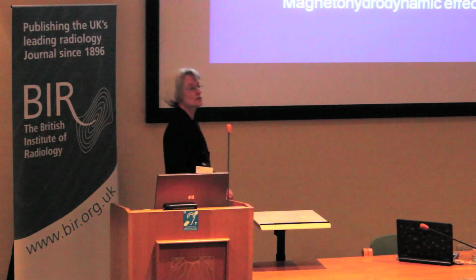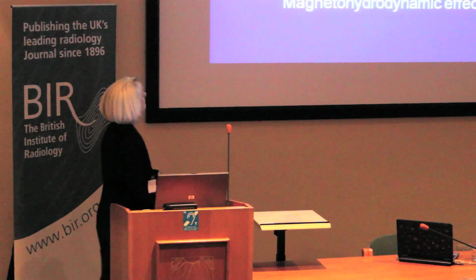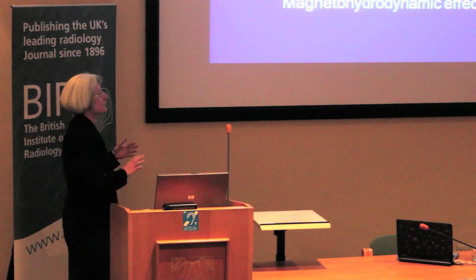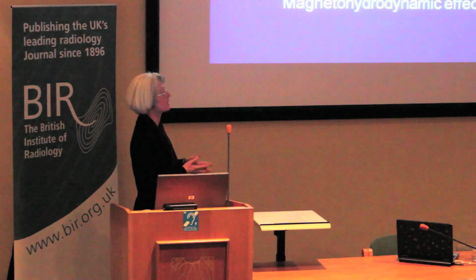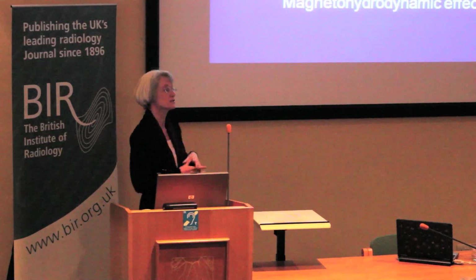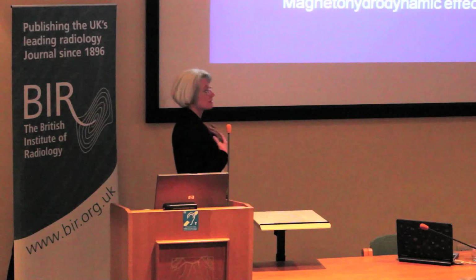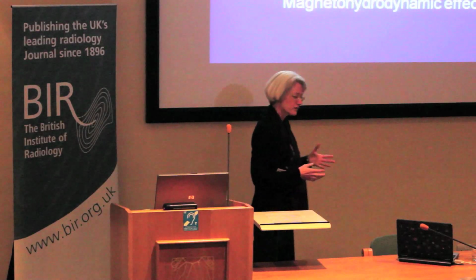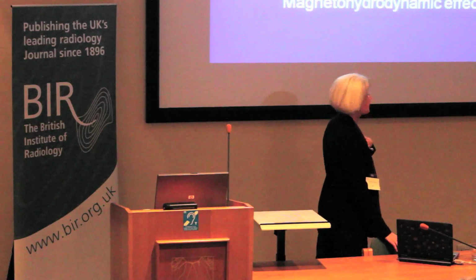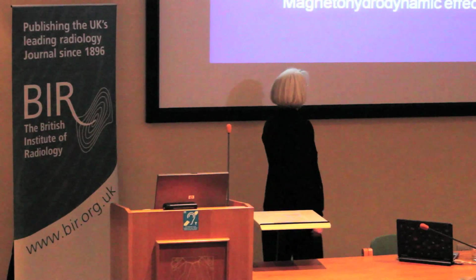The other is, as you all know from your GCSE or O-level physics, you get induced currents. If you have something that's conducting, moving in a magnetic field, it will induce currents in the body. And this is definitely the case in an MR scanner. As you walk around the MR scanner, you'll get some currents induced in your body. They're of the sort of order of the currents induced in the surface of your body by your heart beating.